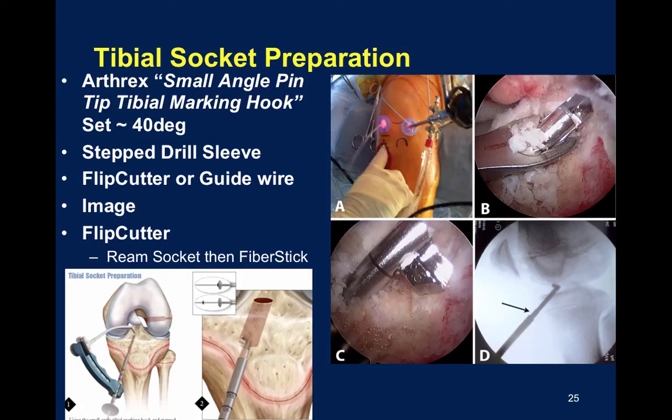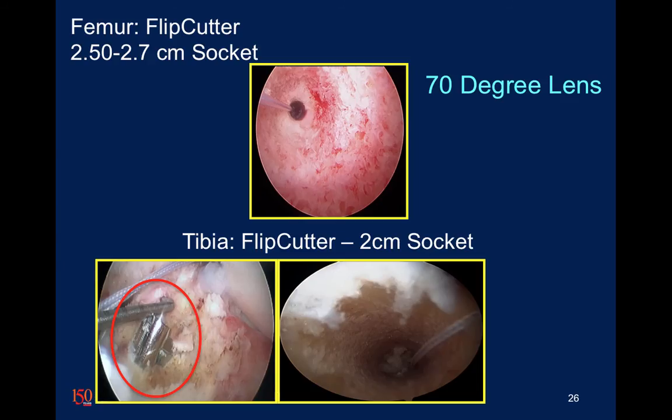Following similar steps: confirm x-ray, place the flip cutter in the knee, flip the flip cutter, and perform retrograde drilling to create the tibial socket.